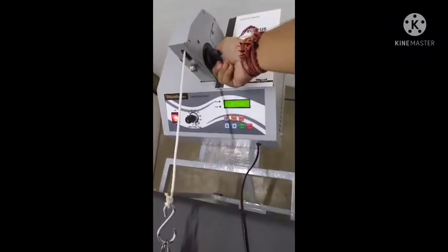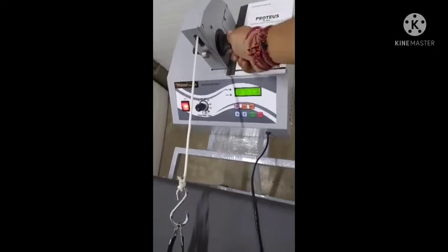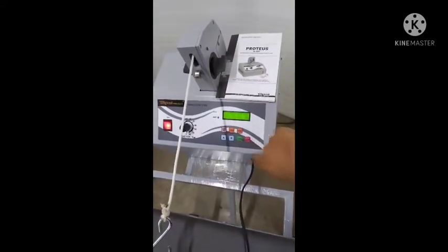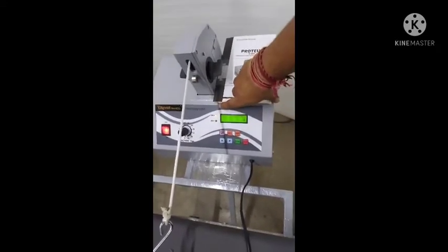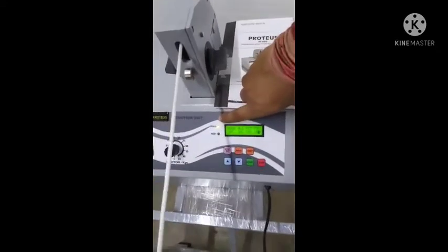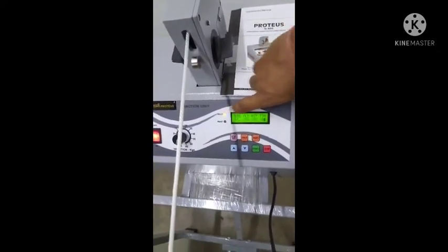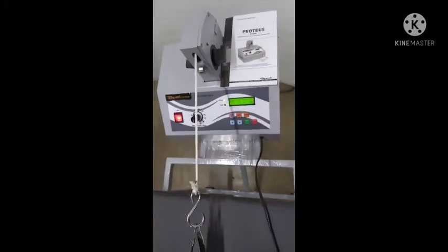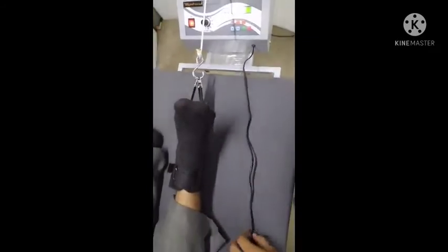Before we start, we have to hold the knob and we press start. So treatment is started and the hold phase shows the hold period. Here is a safety key.